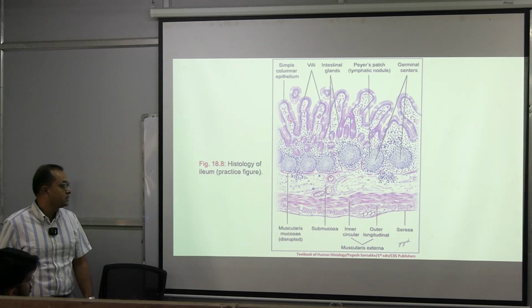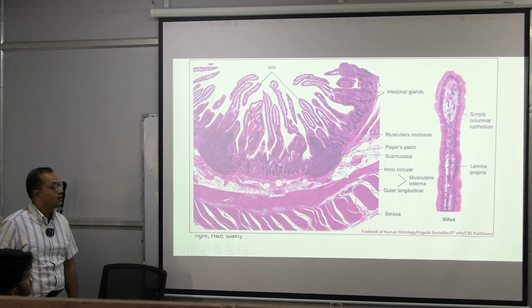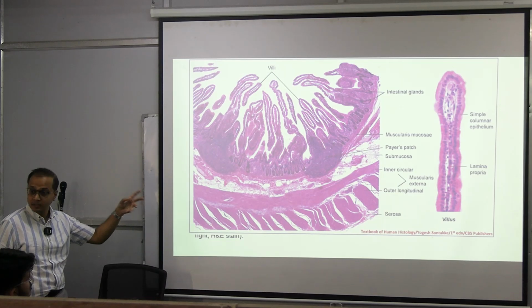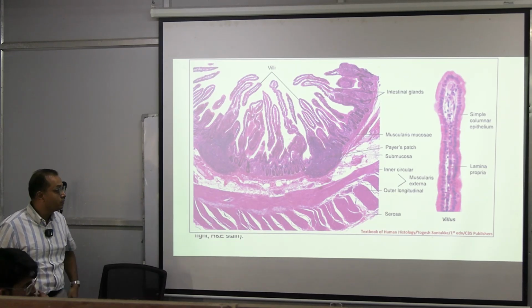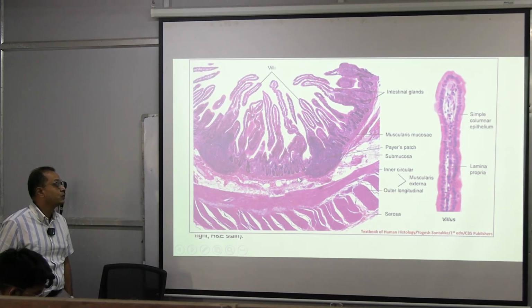So, the small intestine has the same general features like this, and this is what we call the Peyer's patch, which should be present under the villi but is not restricted to the region of the lamina propria. It may reach into the submucous layer, breaching the muscularis mucosae and reaching the submucous coat itself.